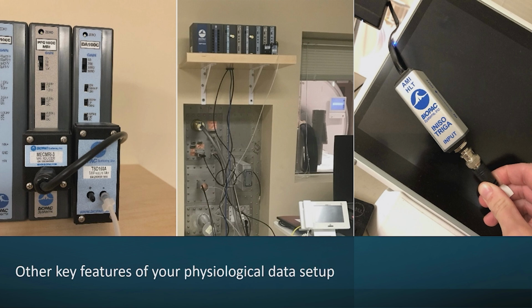If there are loops or notches, or if anything is messed up with those cords, you're going to have very different readings than what you would like to see. So making sure that, however crazy it might look, you have very continuous and clean cord wrapping and coiling is very important in terms of the quality of the data.